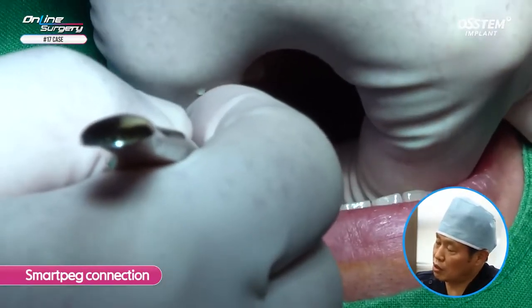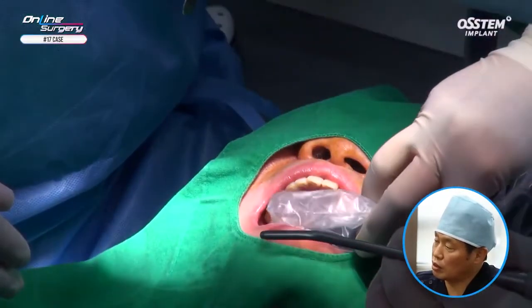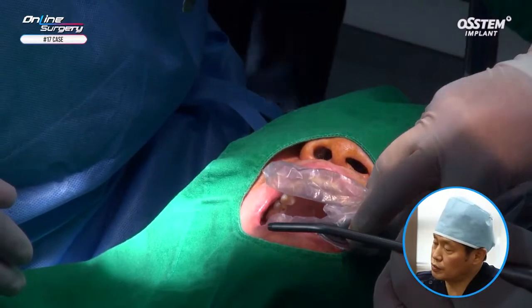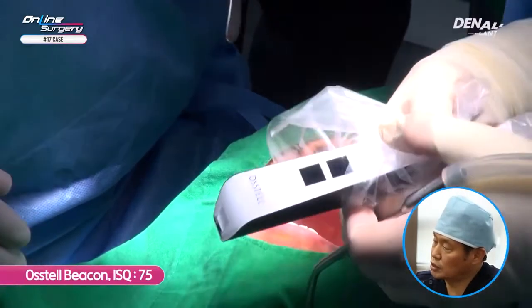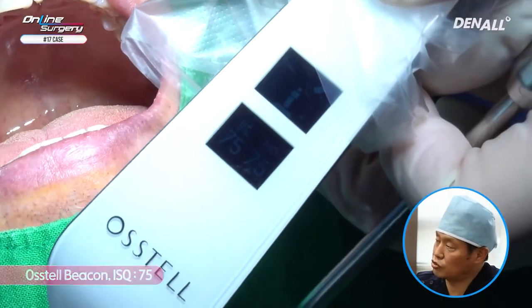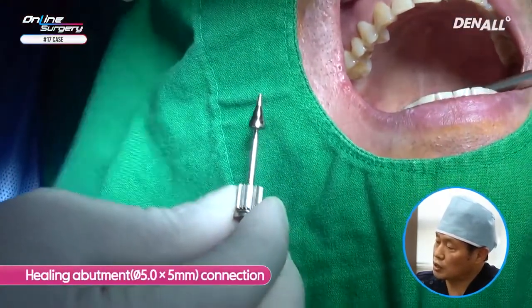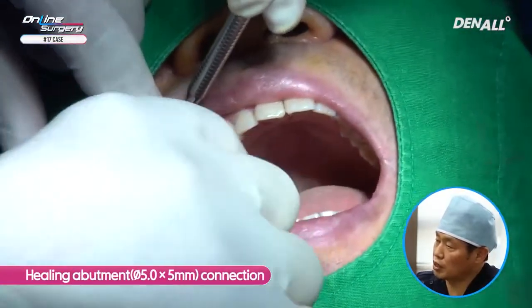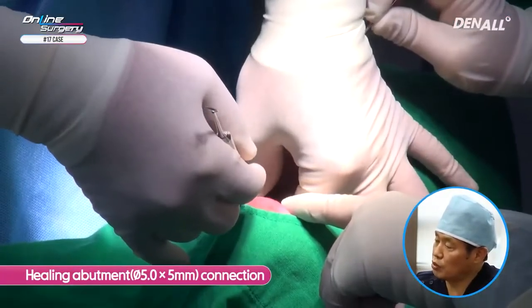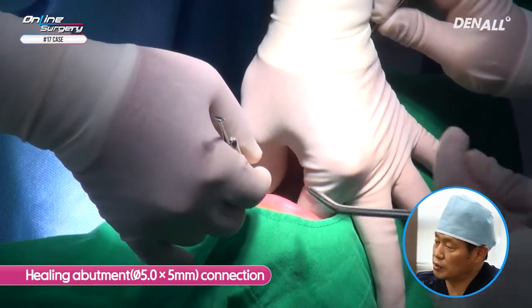After removing the template, I connected SmartPeg to check initial stability. Using Osstell Beacon to measure, the ISQ value is approximately over 75 — initial stability is good. Therefore, a 5.0 by 5 healing abutment has been connected. Surgery is now complete.